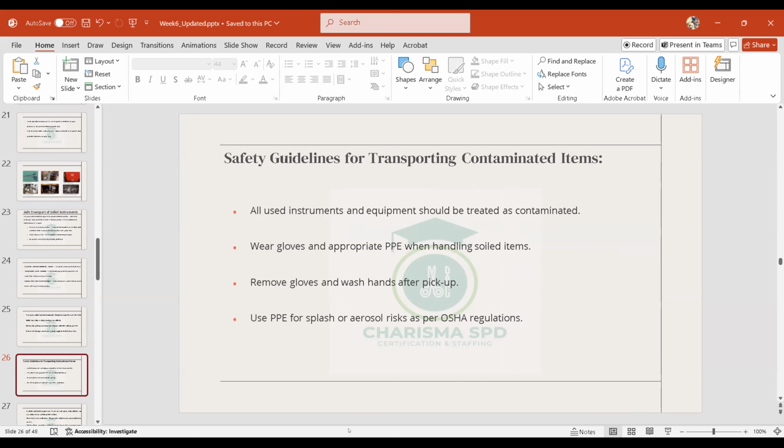That is what we call, in sterile processing language, standard precaution. Regardless of whether you see blood, fat, or any bone chip, anything coming to the decontamination area or room is deemed dirty, whether you see physical blood or not.